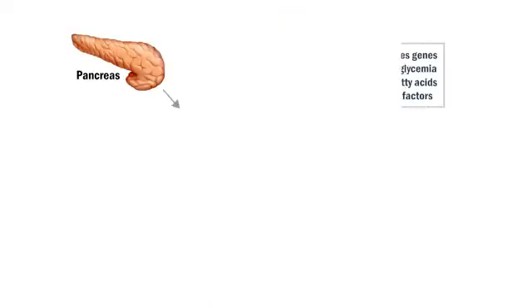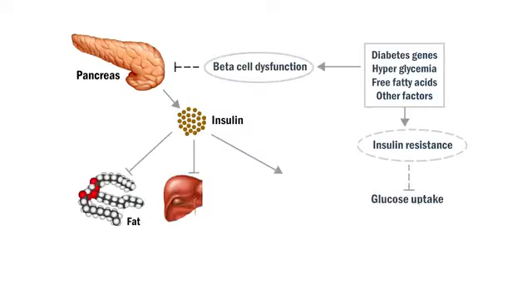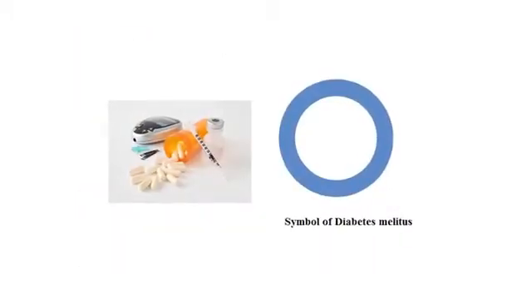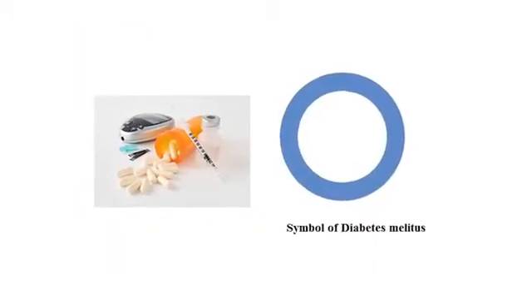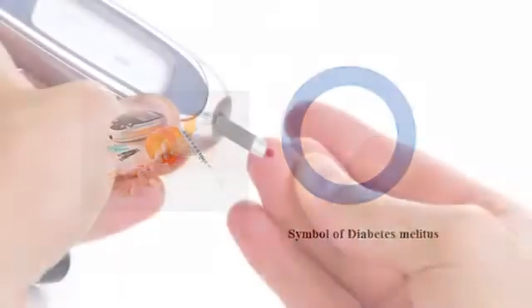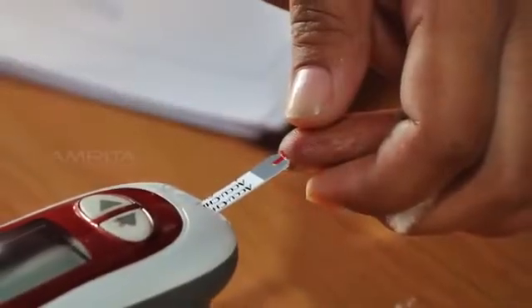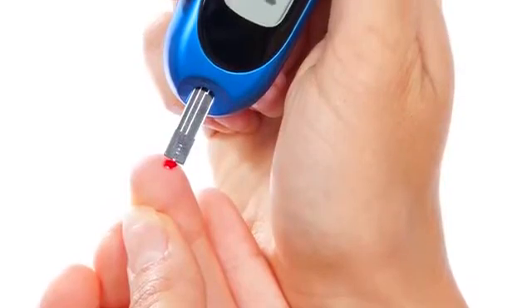A defect in insulin secretion, insulin action, or both results initially in impaired glucose tolerance and causes hyperglycemia, which further leads to diabetes mellitus. So a simple, rapid and economical method of determining the blood sugar level is obviously needed, especially in the management of diabetes mellitus.